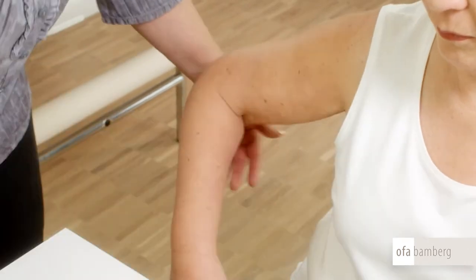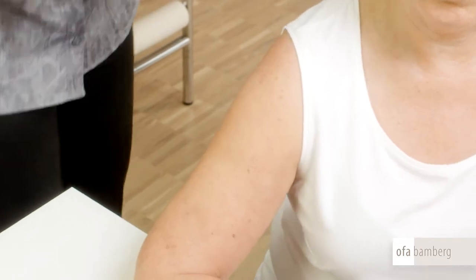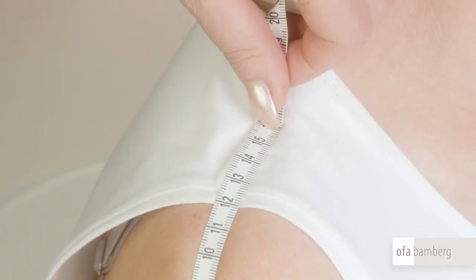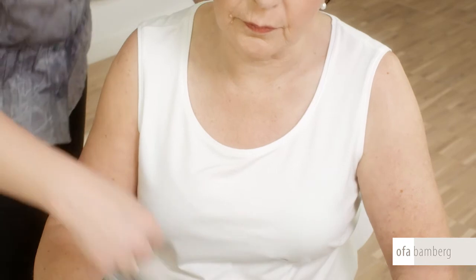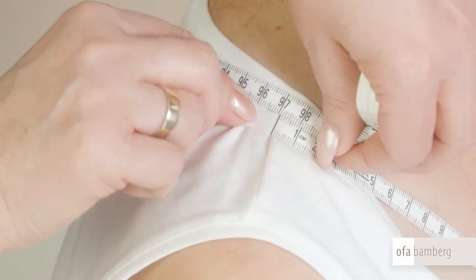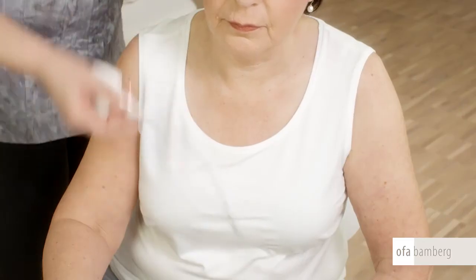If the stocking is fastened with a support strap, it is necessary to measure length GH. In this case, starting from measuring point G as previously marked, measure up to shoulder height H. The strap's length can be determined by measuring from point H across the trunk back to point H. Where the arm's circumference is wide, it is recommended that a grip top is sewn on.